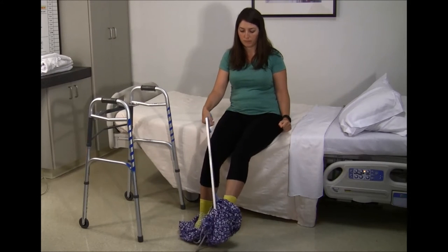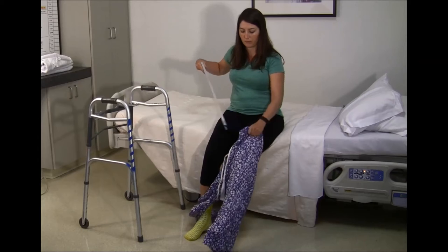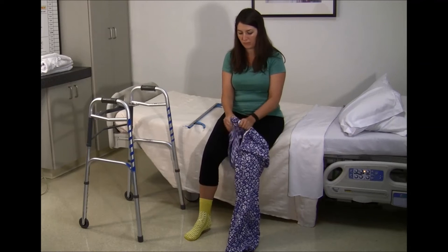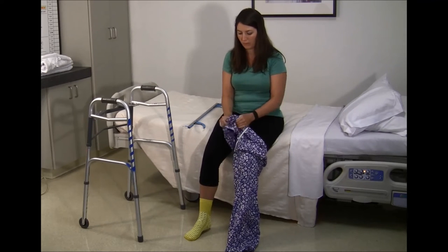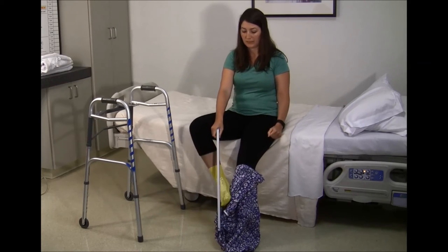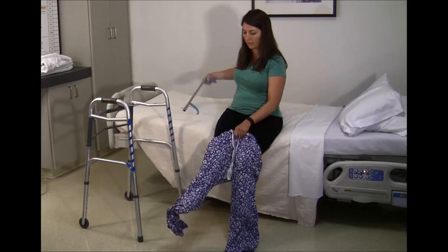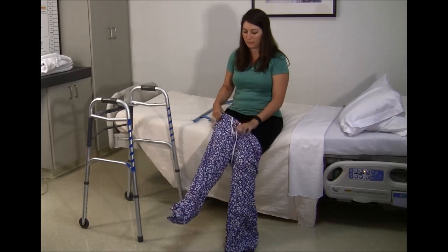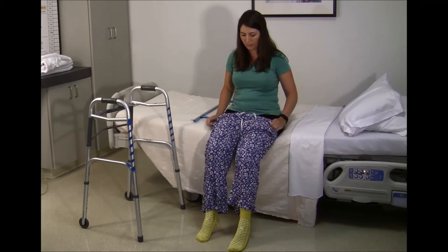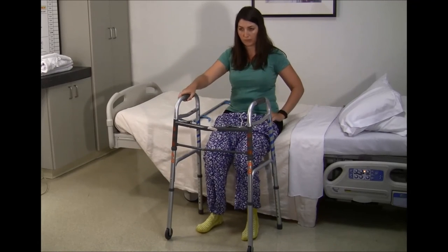Bring the pants up towards your hands, then switch the reacher to the other side of the waistband and do the same on the other side. Hold them up as high as you can while still sitting in the chair or on the bed. Then stand up and pull the pants up. Use the walker to assist with balance — hold on with one hand and pull up one side at a time.